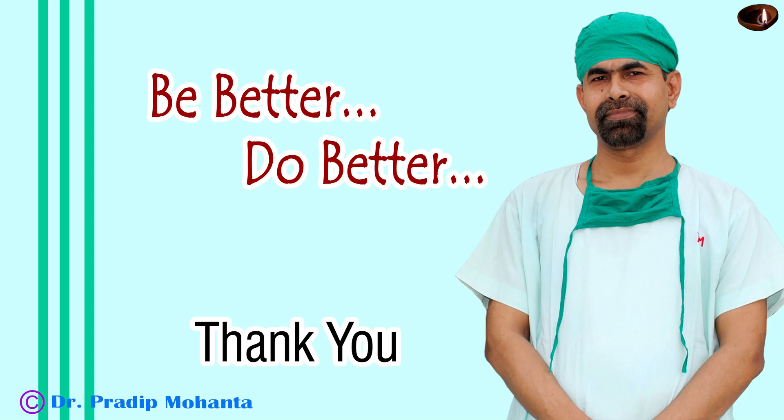Thank you very much for your attention. Hope this video will encourage you to use Mohanta's prechopper. Surgery will be effortless if we can divide the nucleus — especially in soft cataracts — into 3 or 4 pieces.